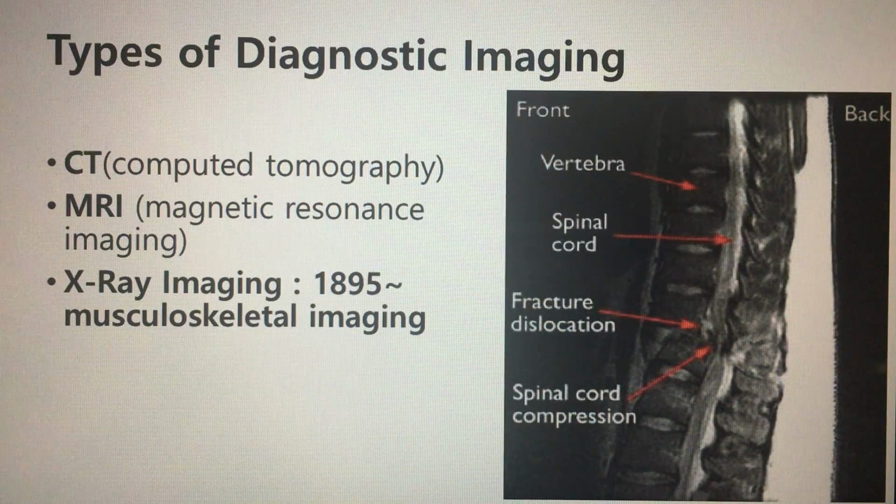Computed tomography, so-called CT scan, makes use of a computer-processed combination of many X-ray measurements taken from different angles to produce cross-sectional images of a specific area of a scanned object, allowing the user to see inside the object without cutting. CT scan is referred to as multiplanar reformatted imaging by using X-ray.